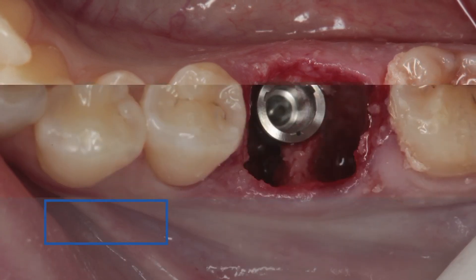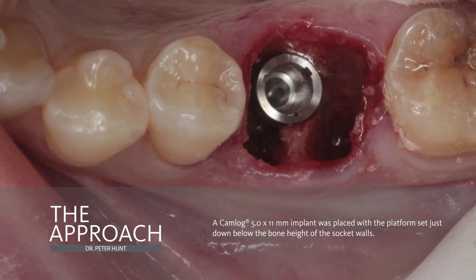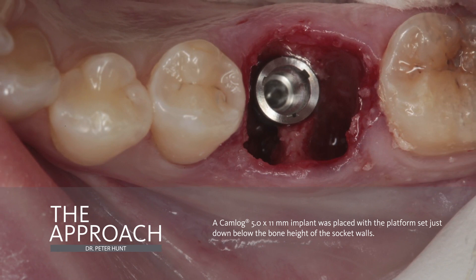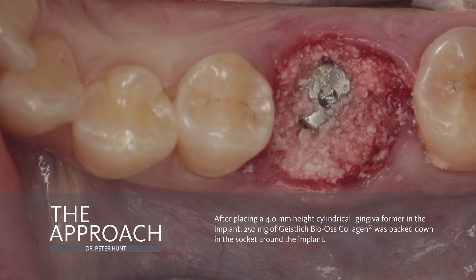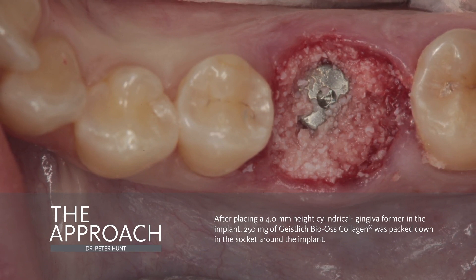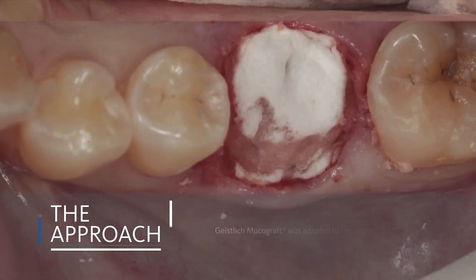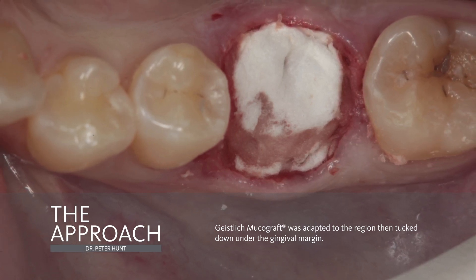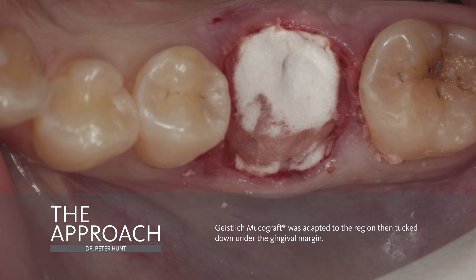And in the next situation, what I'm able to do is to place an implant. I'm also placing the platform a little below the sides of the proximal bone walls. You don't want the implant to be too high in the socket here. Once the implant is placed, we place a 4-millimeter gingiva former in the top of the implant. In this region here, you can now see that I've covered around and packed down a whole lot of Bio-Oss collagen into the region. And now we've taken a large mucograft material, a membrane here. What I'm doing is tucking this down under the gingival margins. Often we may soak it, and that makes it easier to tuck under the gingival margin.